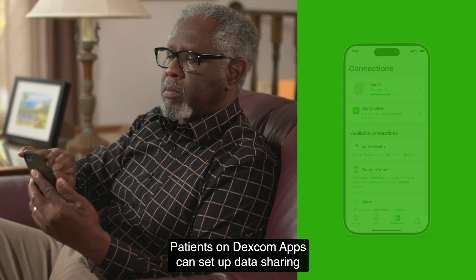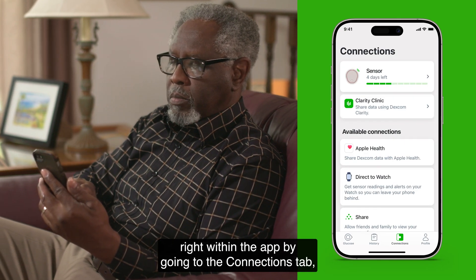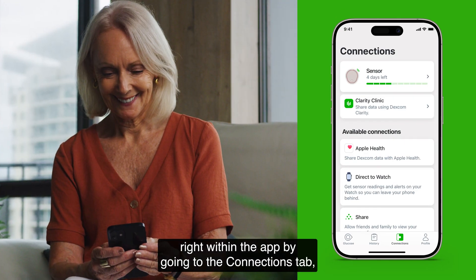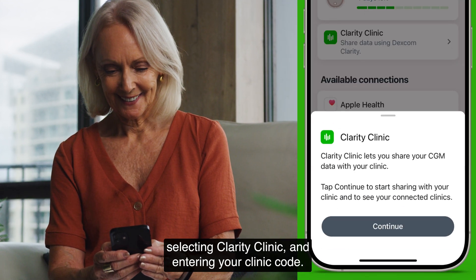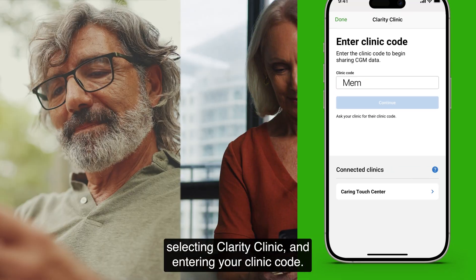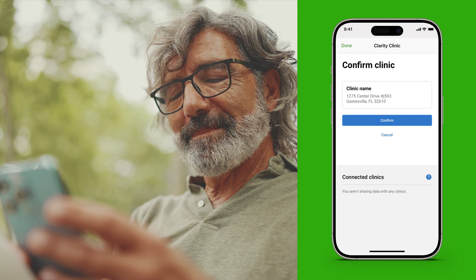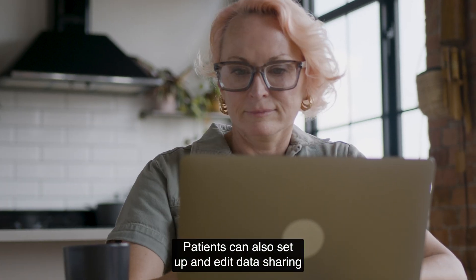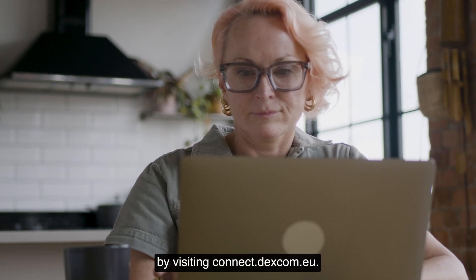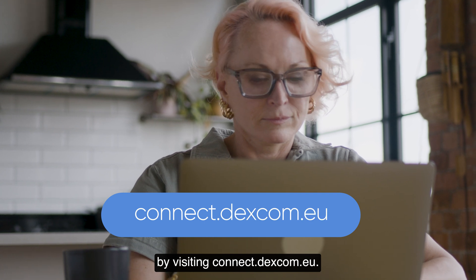Patients on Dexcom apps can set up data sharing right within the app by going to the Connections tab, selecting Clarity Clinic, and entering your clinic code. Patients can also set up and edit data sharing by visiting connect.dexcom.eu.